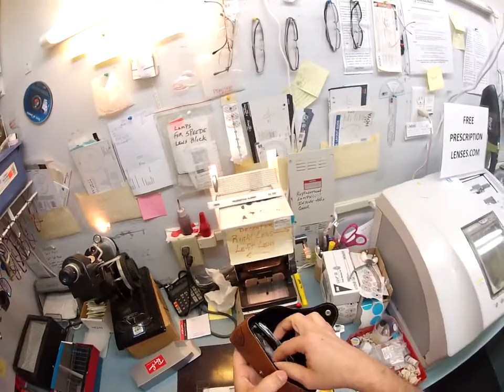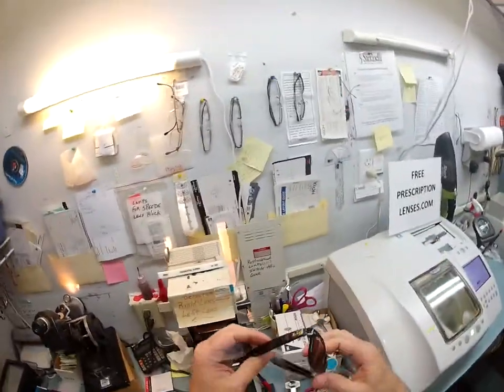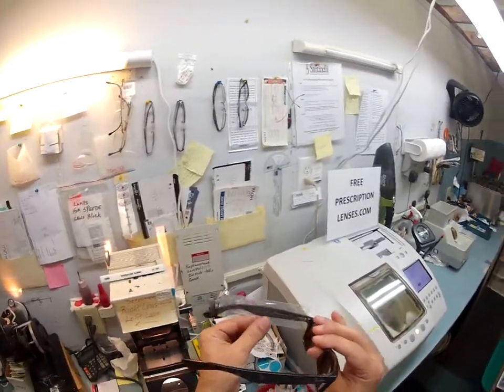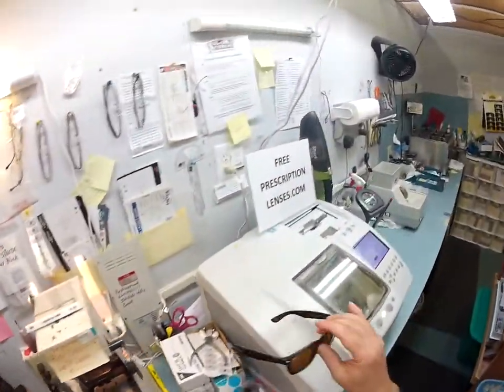I've taken out of the box your Ray-Ban case, your Ray-Ban cleaning cloth, your Ray-Ban frame with the little protective sleeve on one temple. If Ray-Ban thinks it's a good idea to send one temple sleeve, I'm gonna add a second one to the other side when I ship to you — that's the only difference.